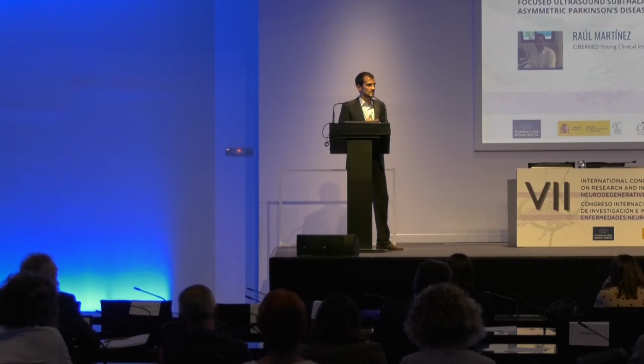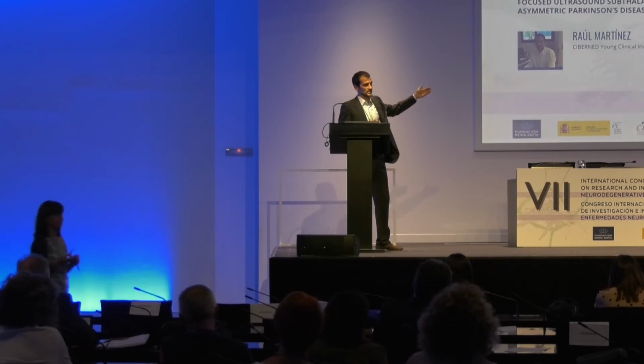The other question, it's true, we don't have electrophysiology, of course, but we have imaging, we have MRI imaging. And in fact, so far, a lot of groups do deep brain stimulation without electrophysiology, only with imaging. Imaging has improved so much that we think we can do it safely. In fact, we also have the continuous clinical assessment that I showed.